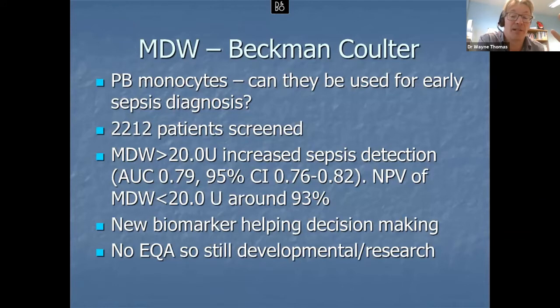What struck me was that this is something using the data that we already had, related to perhaps those research parameters that are coming out from the machine. You get a number, but ultimately behind the screen, we can extrapolate sizes and complexities, and use that information to maybe help with patient care. So it's a new biomarker as such.